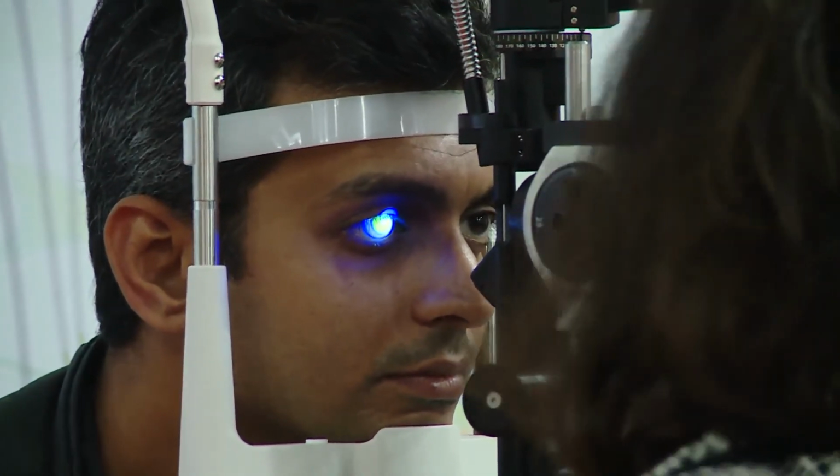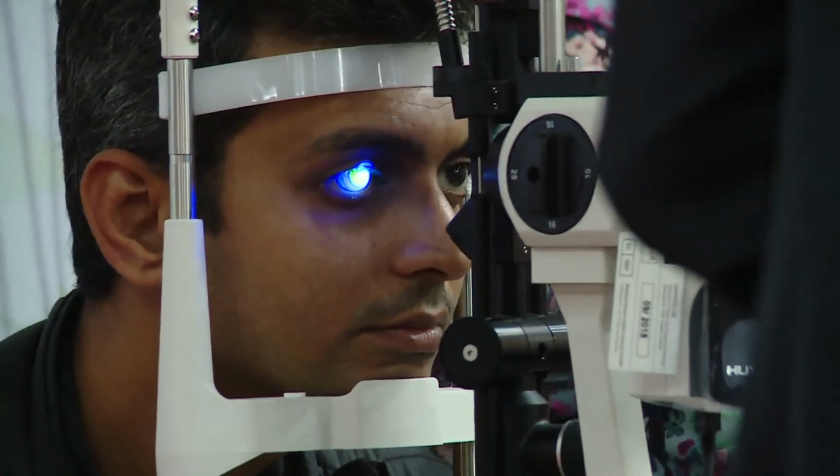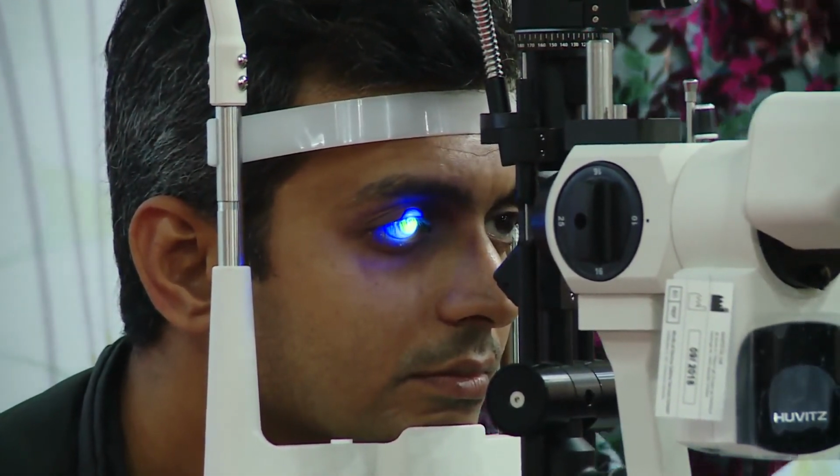Jyoti, just turn the light up a bit more, thanks. Just the illumination a bit higher on your slit lamp. Highest, is it? Okay, can you see here now, hopefully? Just lift his top lid up a little, Jyoti, and get him to look straight ahead. Keep him looking straight ahead.